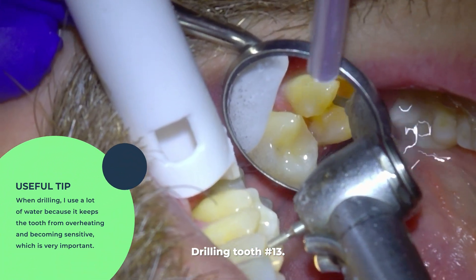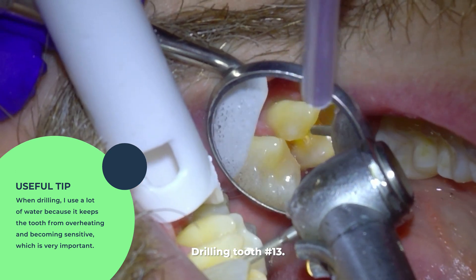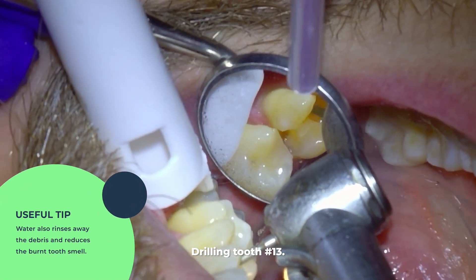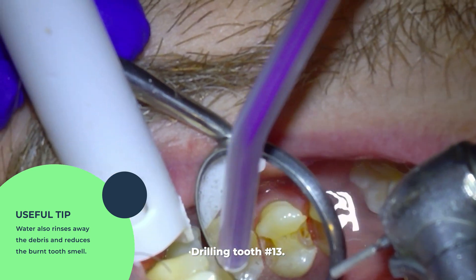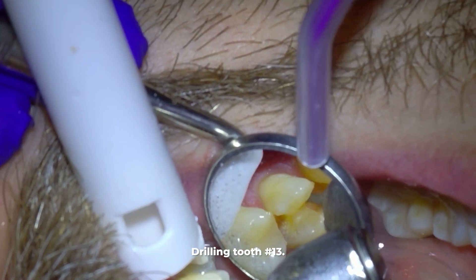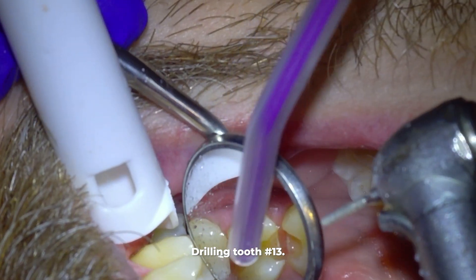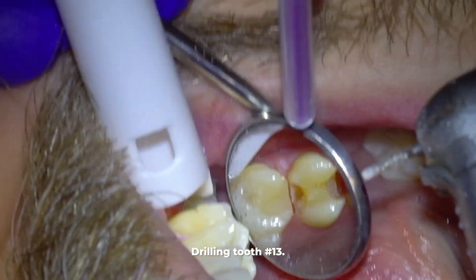When drilling I use a lot of water because it keeps the tooth from overheating and becoming sensitive, which is very important. The water also rinses away debris and reduces that burnt smell of tooth. The main reason for the water is to reduce the chance of sensitivity — if the tooth heats up too much it can cause inflammation, the tooth can die, and eventually get an infection.